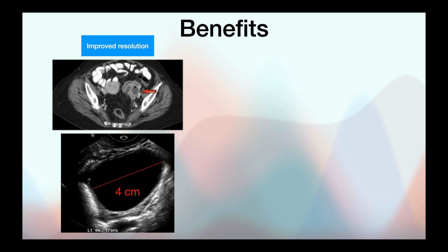So, why is ultrasound usually first-line imaging in reproductive health problems? First, the spatial resolution actually exceeds that of radiography and usually CT, and it can often be comparable to MRI imaging.